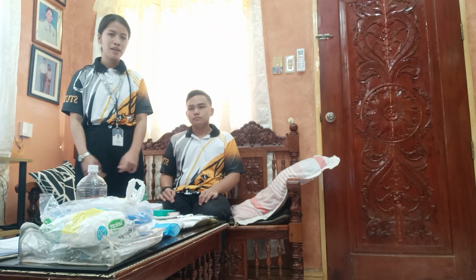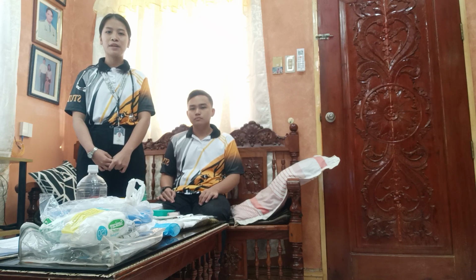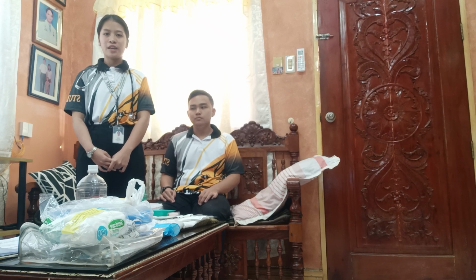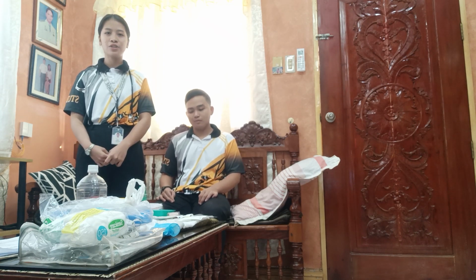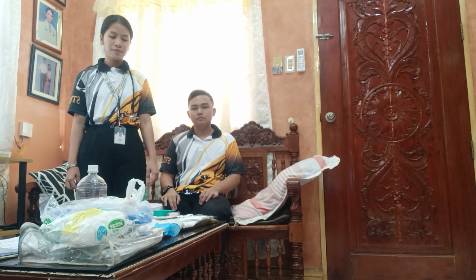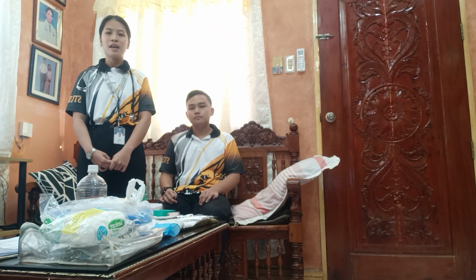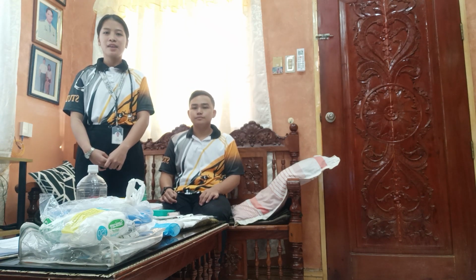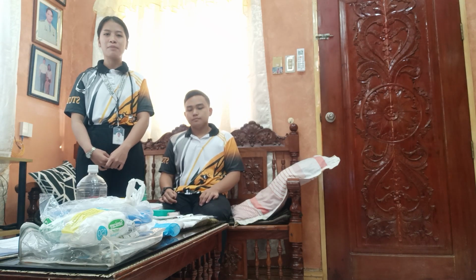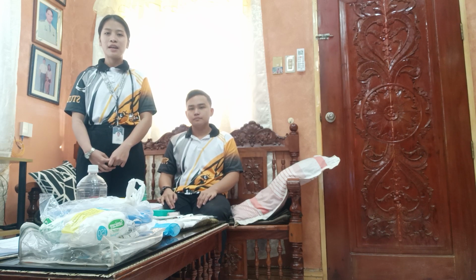So for the equipment po, we have nasogastric tube, stethoscope, water-soluble lubricant, normal saline solution or sterile water for the irrigation, tongue blade, irrigation set including the funnel, and also the flashlight, non-allergenic tape, tissues, glass of water with straw, topical anesthetic, it is optional, clamp, suction apparatus, bath towel or disposable pad, emesis basin, safety pin and rubber band, non-sterile disposable gloves, additional PPE as indicated, tape measure or other measuring device, skin barrier, and lastly, pH paper.